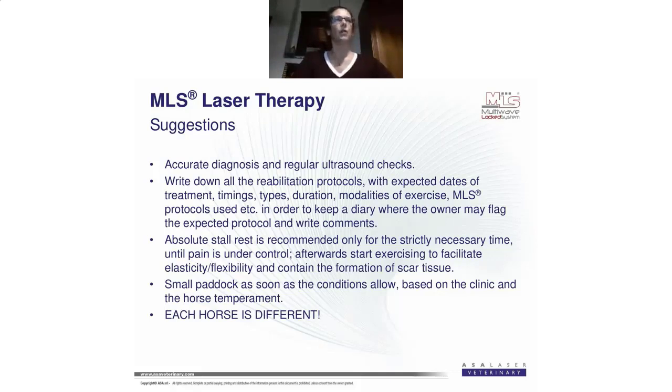So, some suggestions. First of all, accurate diagnosis and regular ultrasound checks. Write down all the rehabilitation protocols with expected dates of treatment, timing, types, duration, modalities of exercise, MLS protocols used.